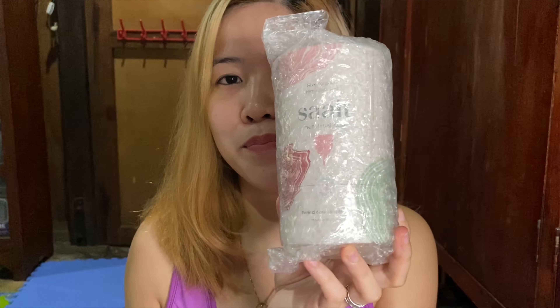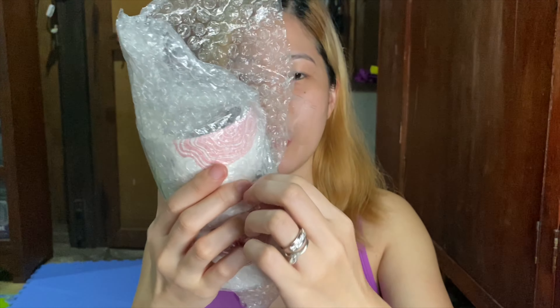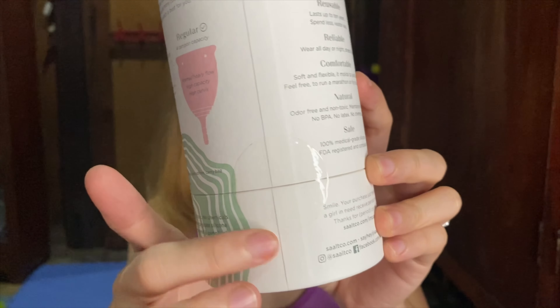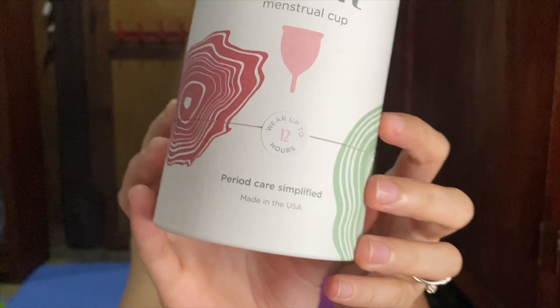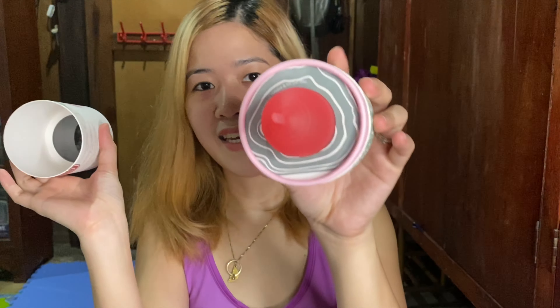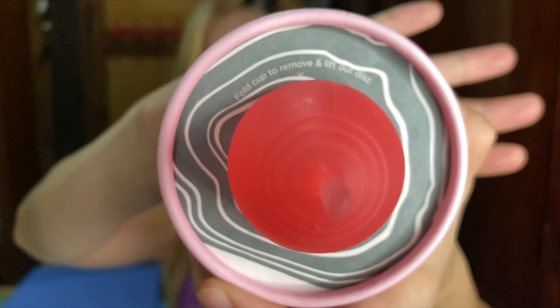For today's video I'm gonna talk about menstrual cup. Let's open it first — I bought this in Shopee, the name of the store is Lavender underscore 21. It has a seal here, and this one also — this is made in USA. Ayan, Himalayan Pink — ito siya. 'Fold cup to remove and lift out,' this fold natin to remove.